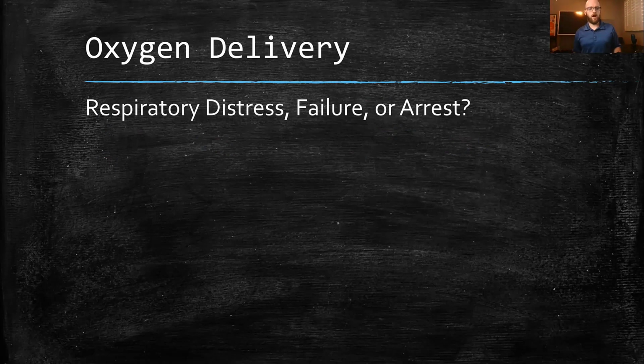All right, so oxygen delivery options. This starts to get into the breathing assessment part, when we said the first step is open the airway, then clear the airway, and then assess breathing. Assessing breathing is really figuring out how they are doing on their own, and that's going to guide what I'm going to do in terms of delivering oxygen.